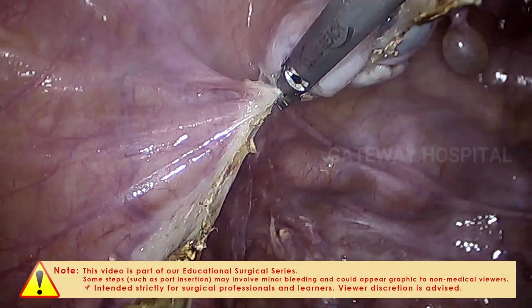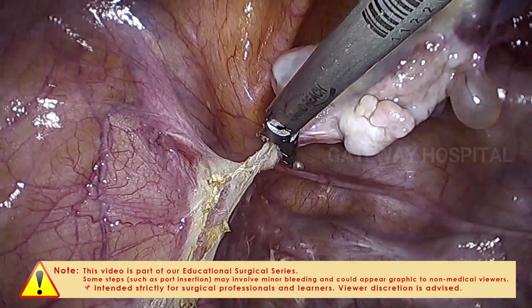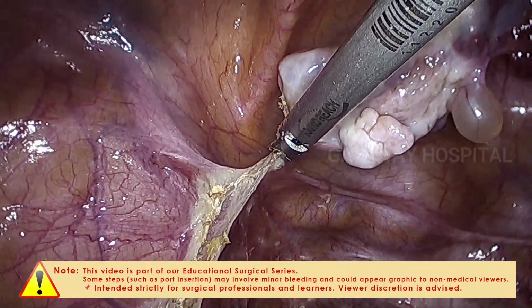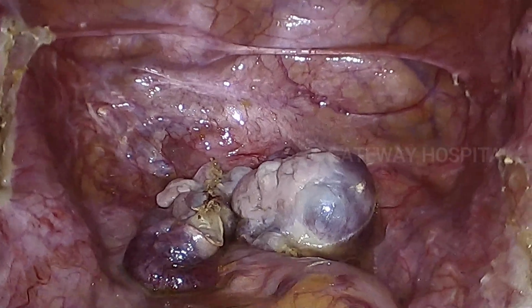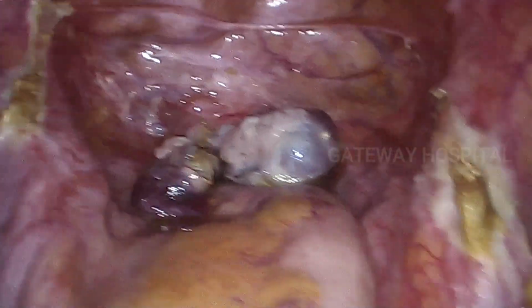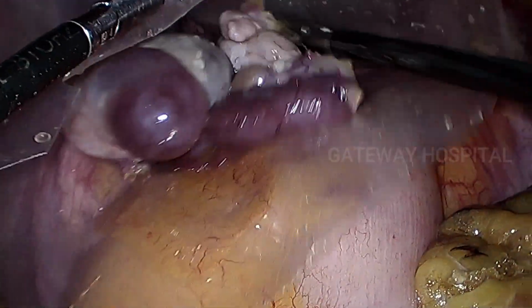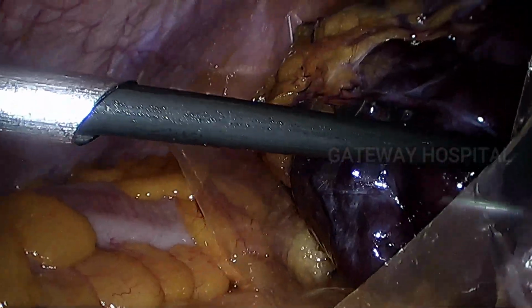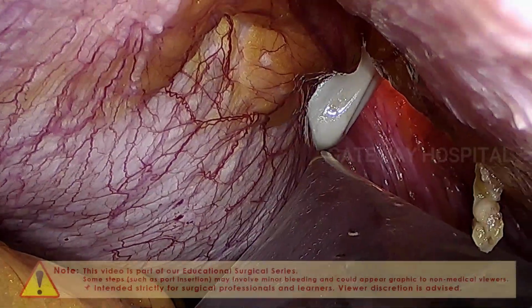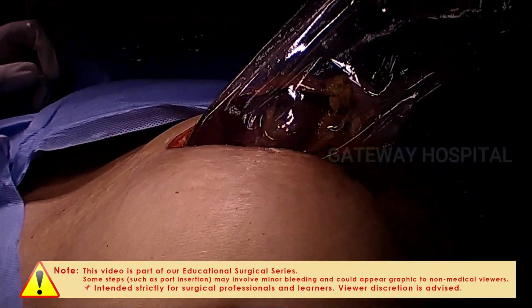So this is the freed specimen, both right side tube and ovary and left side tube and ovary. And this is the port placement. And this is the endo bag which is kept inside. Both the tubes and ovaries are kept inside the endo bag. And by holding the attachment, we are putting the gastrointestinal stromal tumor also into the bag, and we are extracting the specimen through a small Pfannenstiel incision.